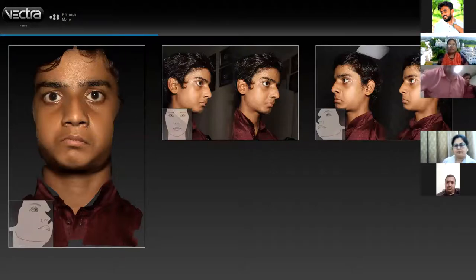It will be further evaluated, stitched using the software. Can we decide our own points? No, they are fixed points. We have to adjust our distance from the patient so that the two points become a single point. Then we click at that point only, so it is processing.